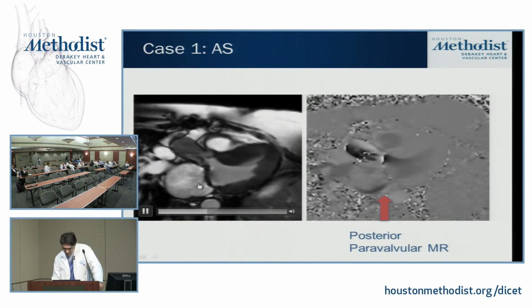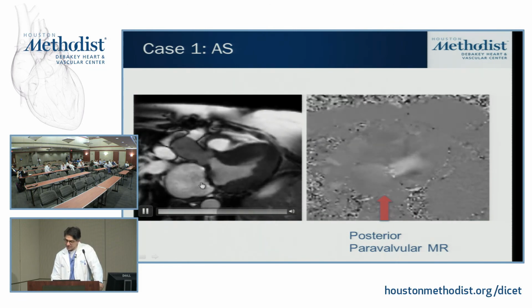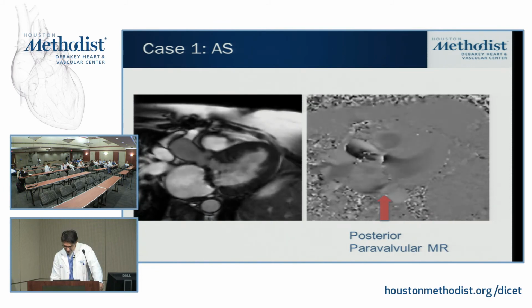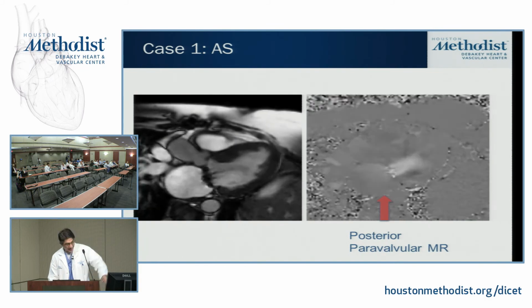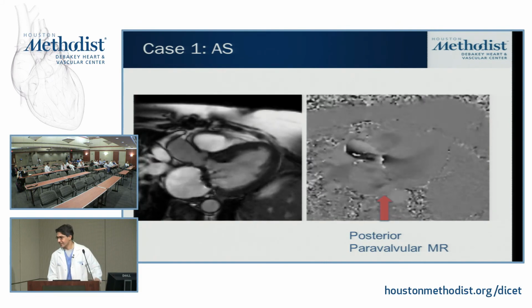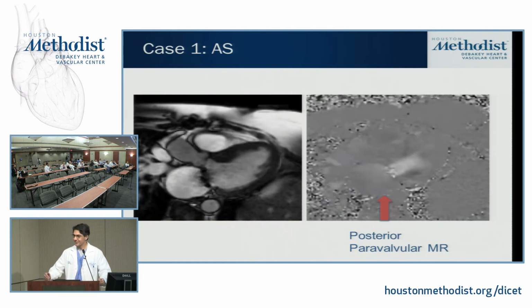Okay, here we go. So there is this kind of puffiness here. Those could be closing jets. Those could be some artifact from the metal there. There was a suspicion here. You see my point? There's a puff of black. Yes, that comes out posteriorly. Yes, and that is exactly what you're seeing on the phase contrast CMR. So it was there for the sake of some excitement in the talk.